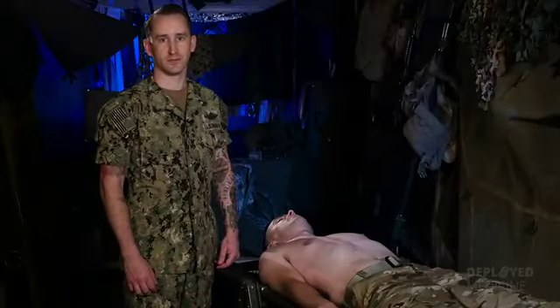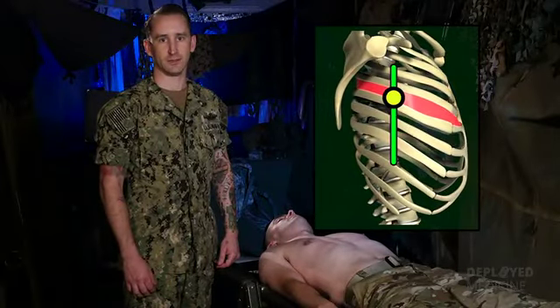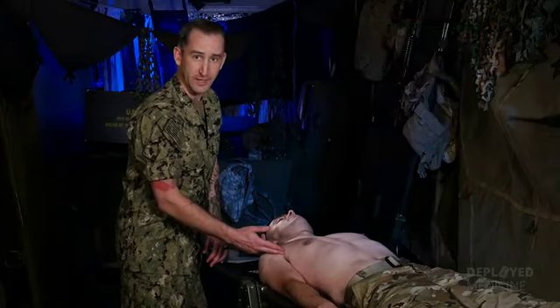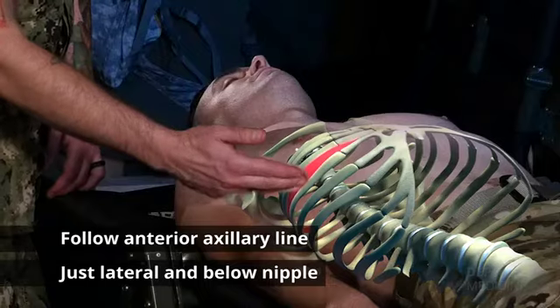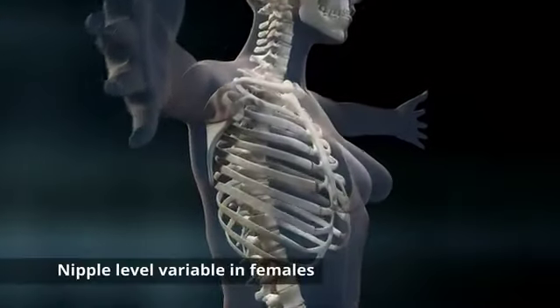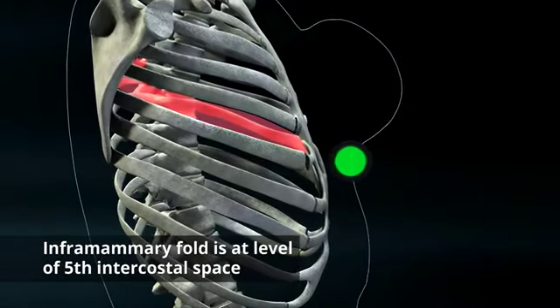The lateral site is located in the 5th intercostal space, anterior axillary line. To locate it, you're going to follow the patient's anterior axillary line to just lateral and below the nipple. The nipple level is variable in females, but you can lift the breast and use the level of the inframammary fold.